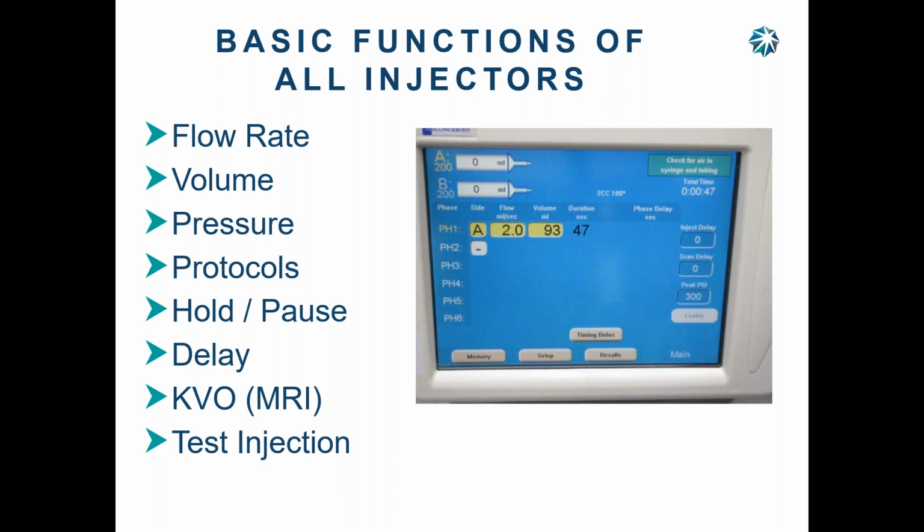KVO, what's KVO? Come on. Keep the vein open. The only injectors that have keep the vein open is MRI. Why is that?